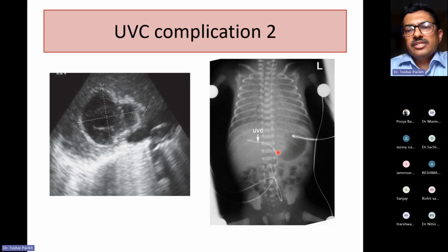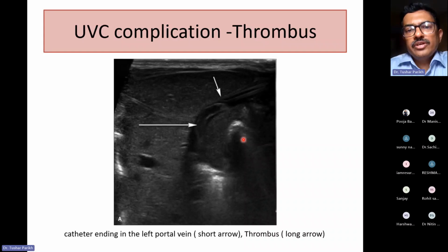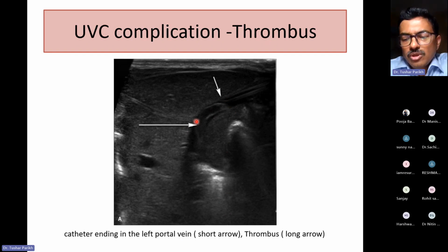Here the line, instead of going into the ductus venosus, which will go like this from this point, has gone into the left branch of the portal vein, and it has gone into the liver parenchyma. It might have gone into one of the tributaries of the portal vein, and that is not good. Now here you can see there is a clot, a thrombus attached to the tip of the line, and again the catheter is ending in the left portal vein. So this is the left portal vein, and there is a thrombus at the tip of the line. So again, this is also not good.